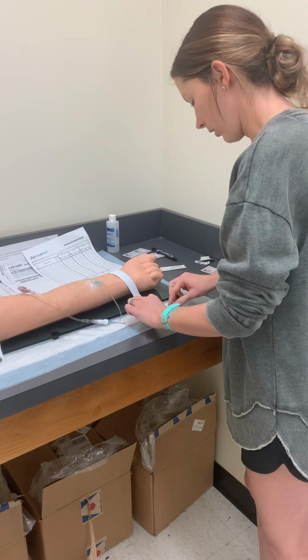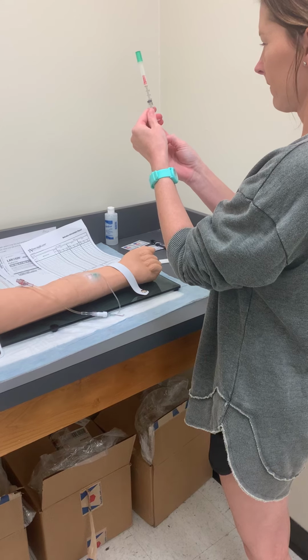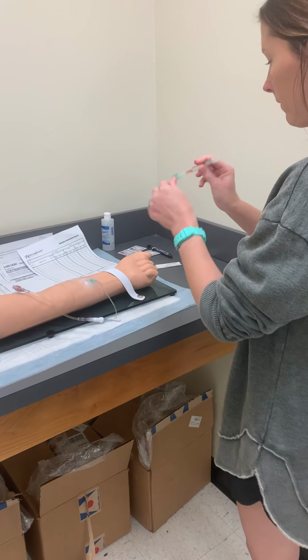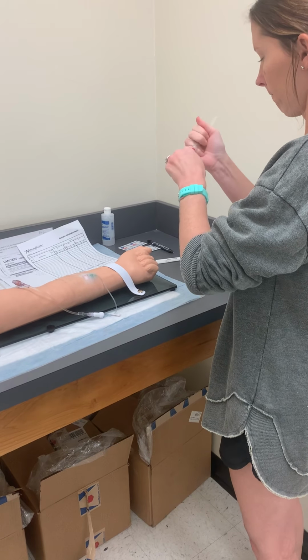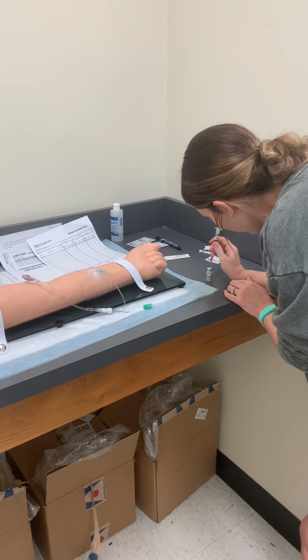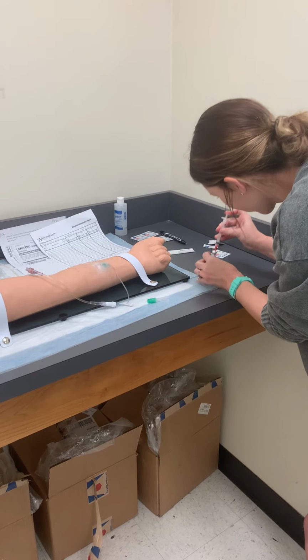I want to pull up my 2 mLs of air and inject my air.